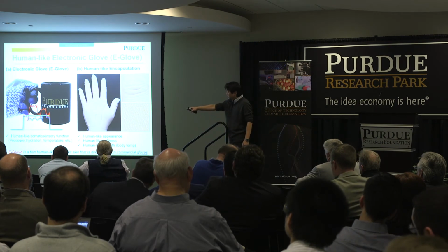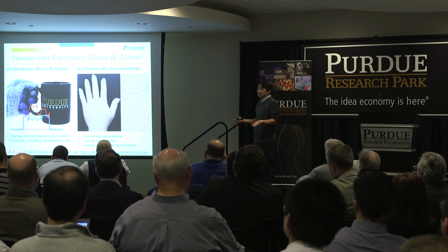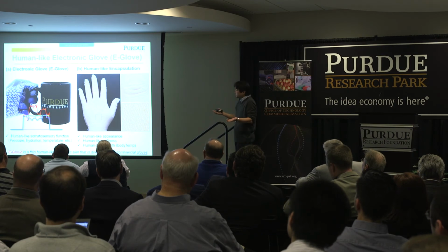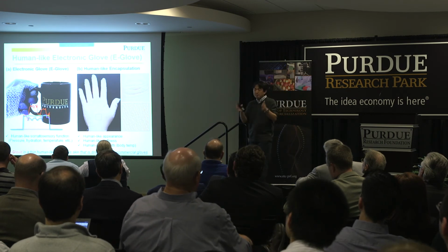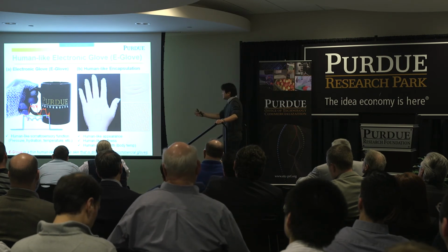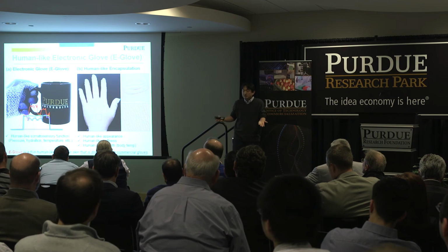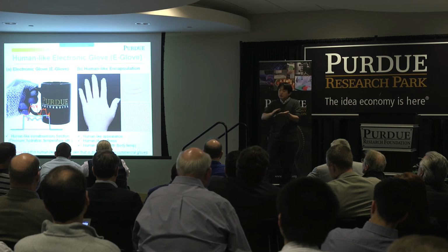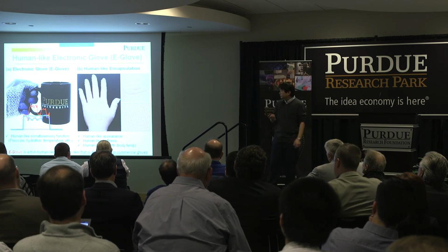And these are the definitions. The e-glove is a thin human-like electronic skin that is directly built on a commercially available glove. This is the key innovative part. Here we use the commercially available glove as a substrate for stretchable sensors. We have a very unique technique that can build functional sensors on top of any kind of glove to detect pressure, hydration, temperature, etc. In addition to that, you can also incorporate human-like encapsulation layers to provide human-like appearance, softness, as well as warmth. You can do this by simply including thermal actuators over the surface to maintain the surface at body temperature all the time or on demand.